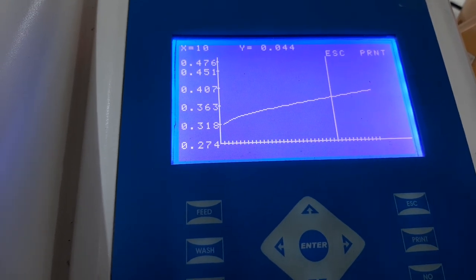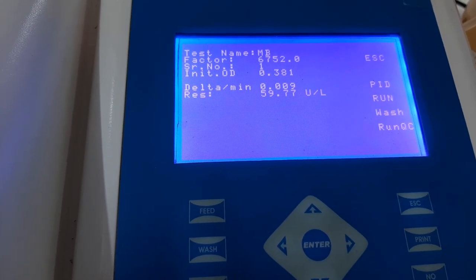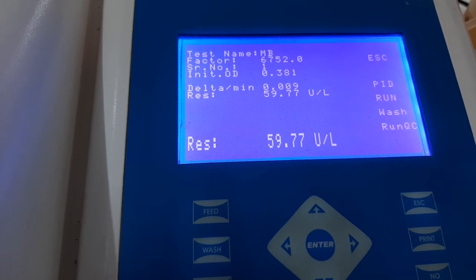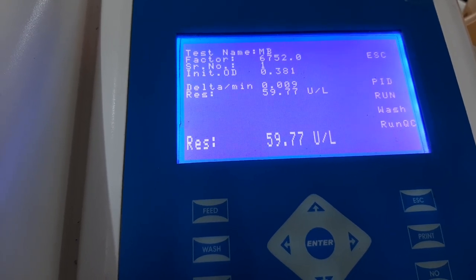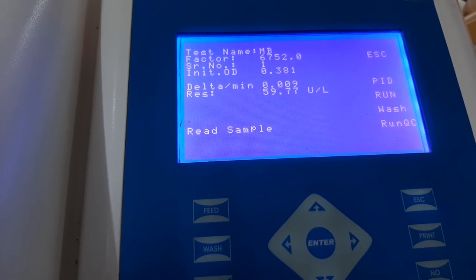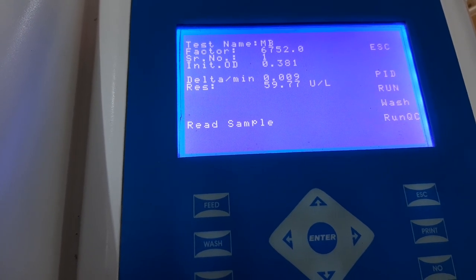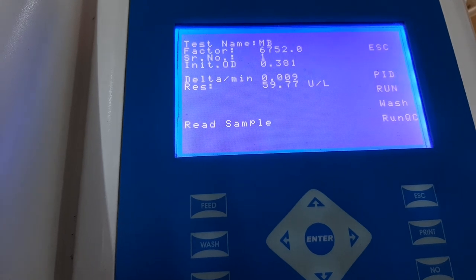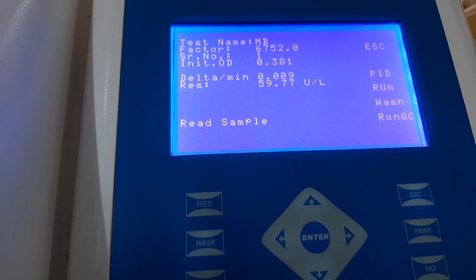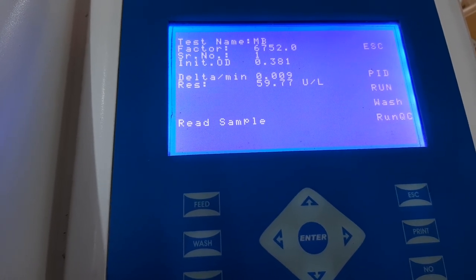After the read time is over, the machine will calculate the delta absorbance per minute and also give the result by calculating it by the factor. If you wish to run more patient samples, follow the exact same procedure. This is the correct way to perform CKMB test. Thank you and we hope this video has been helpful for you.